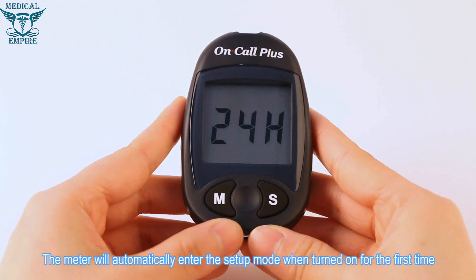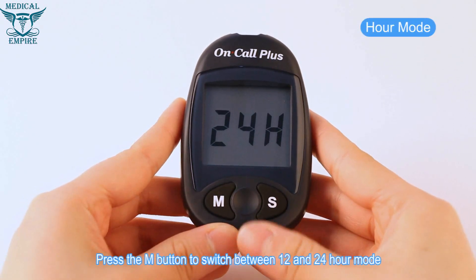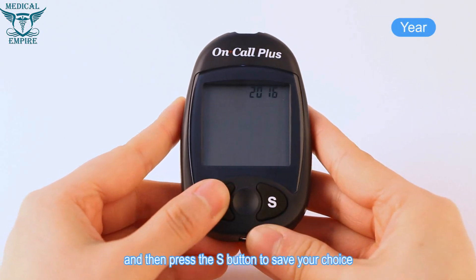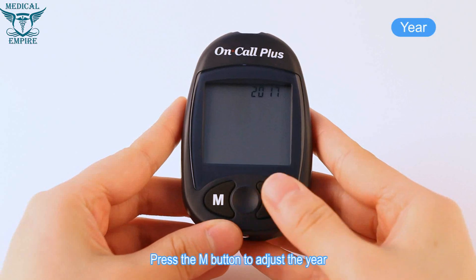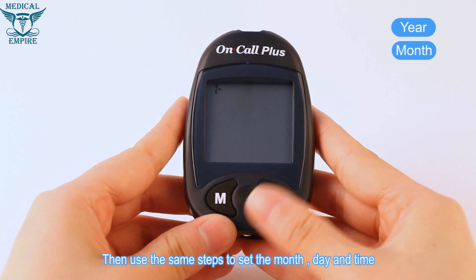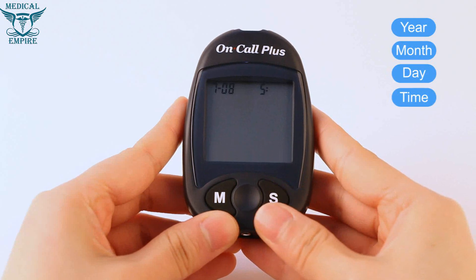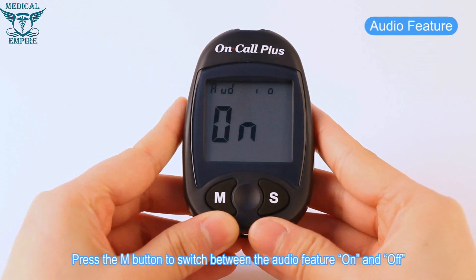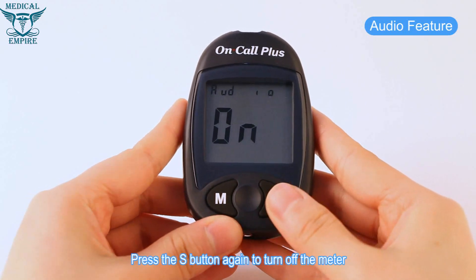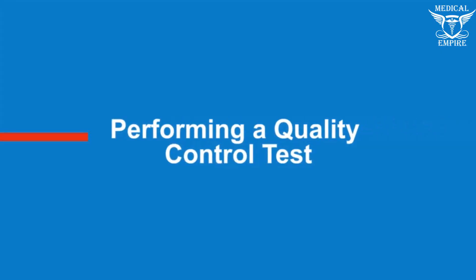Meter setup: before testing, press the S button to enter the meter setup mode. The meter will automatically enter setup mode when turned on for the first time. Press the M button to switch between 12 and 24-hour mode, then press S to save. Use the M button to adjust the year, month, day, and time, pressing S to save each choice. Press the M button to switch the audio feature on and off, then press S to turn off the meter.